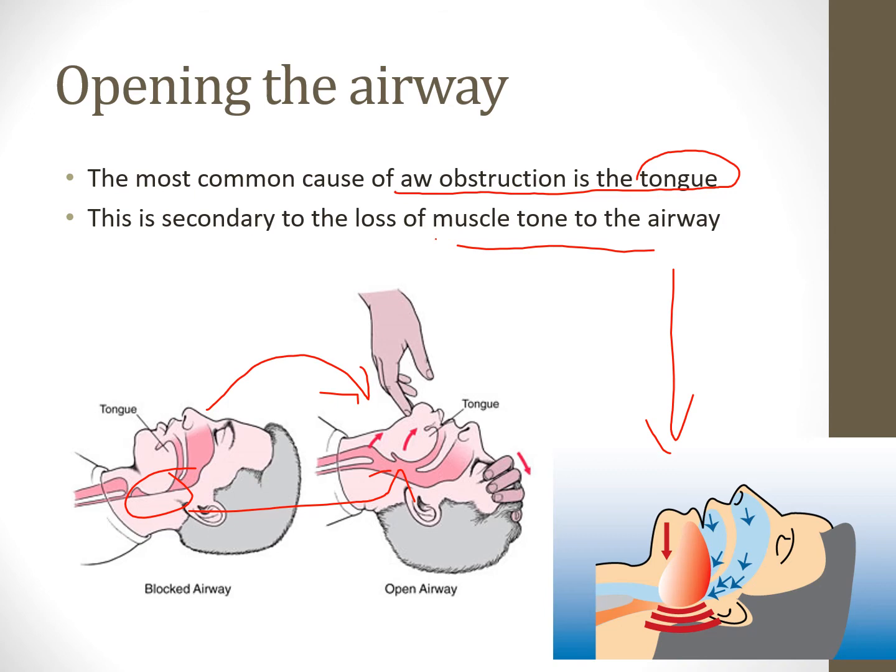Because the nasopharyngeal airway goes down here, behind the tongue, to the entrance behind the tongue, that way it allows gas to bypass that. Well, if the patient's semi-conscious, perfect. If the patient's fully unconscious, not so perfect. If the patient's fully unconscious, then we can use an oropharyngeal airway to keep their airway open while we ventilate or oxygenate.